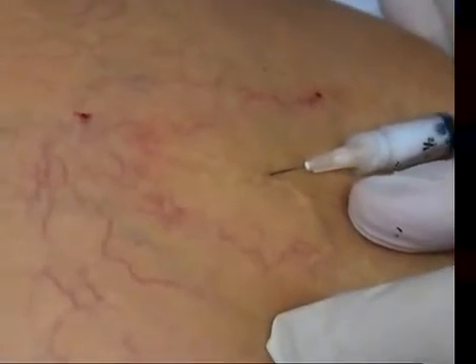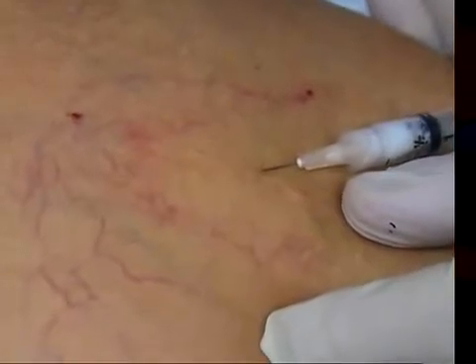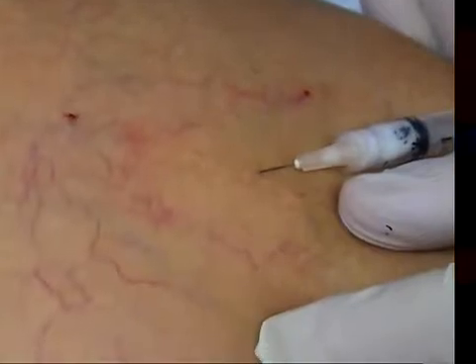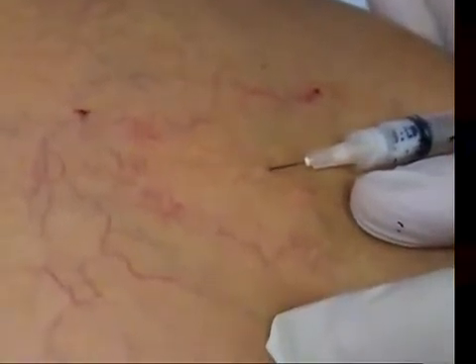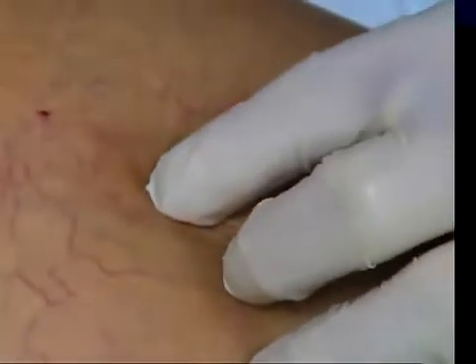This is good for the larger vessels. For the smaller vessels I would go with 0.1% sotradecol. You could use ethoxysclerol, and my good friend Roy Greukin still likes to use a hypertonic saline, but for me this really does the trick.